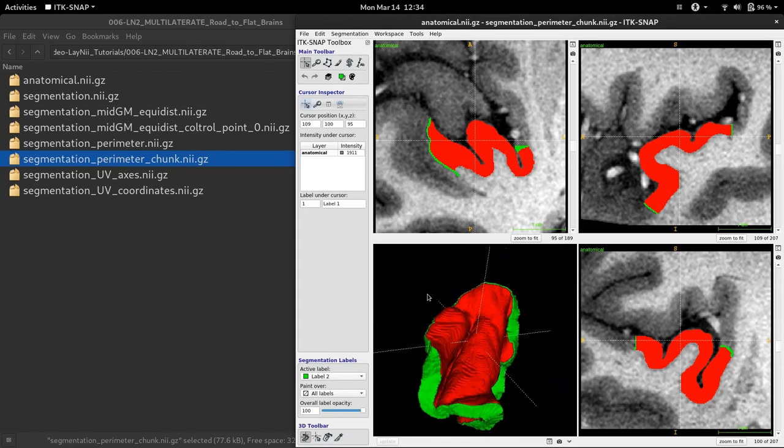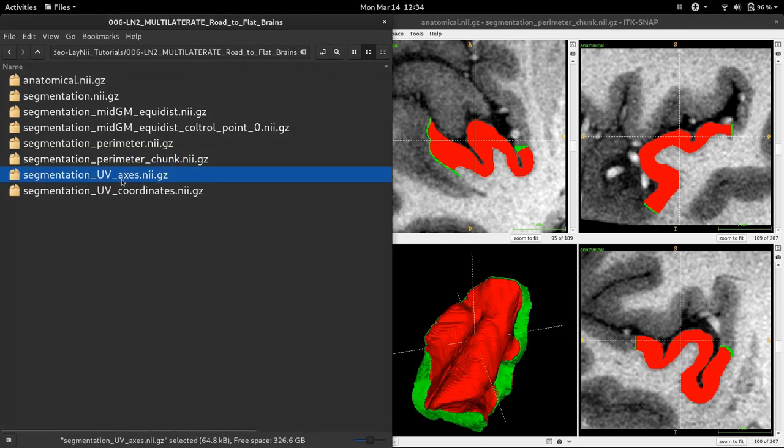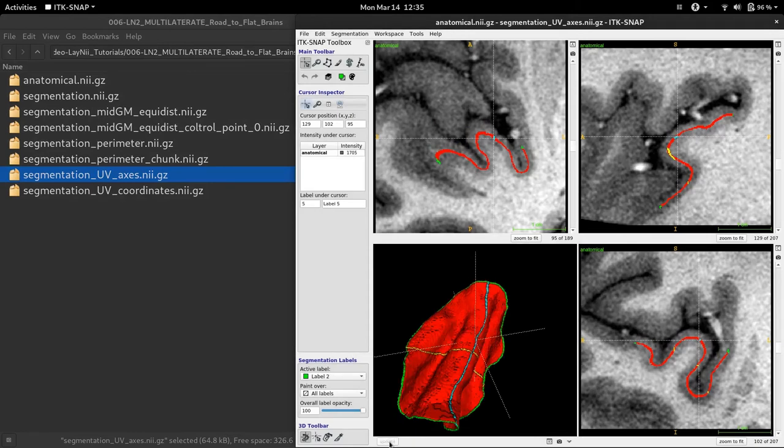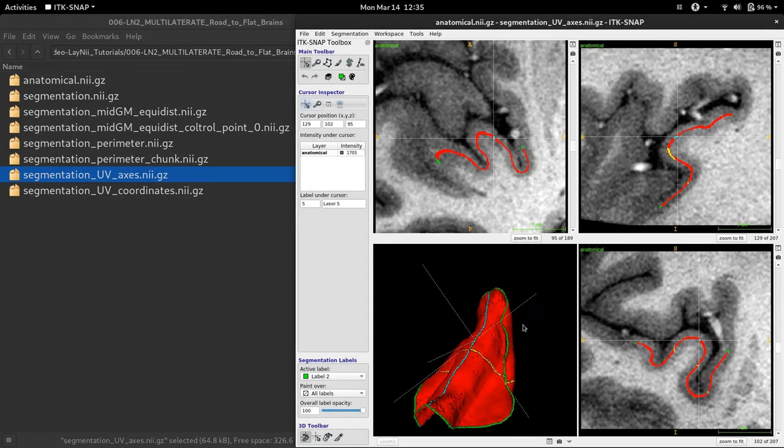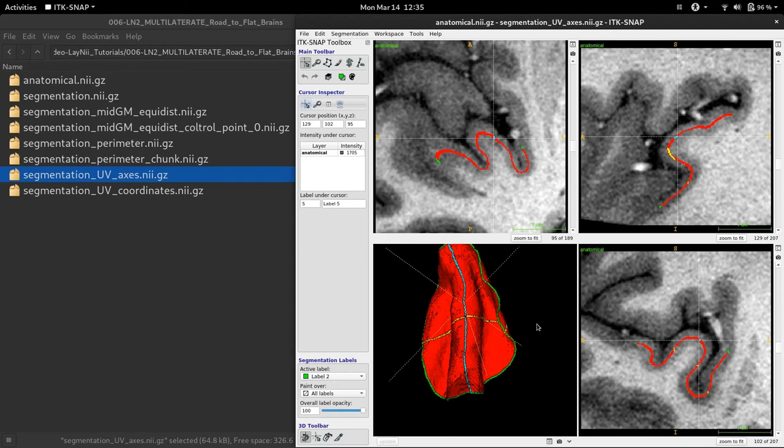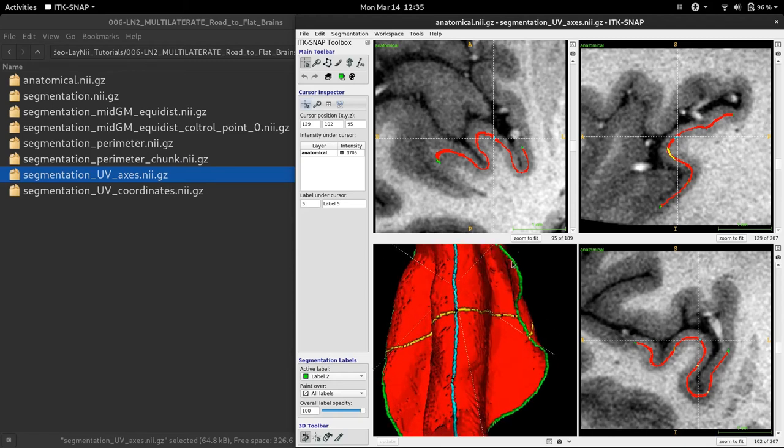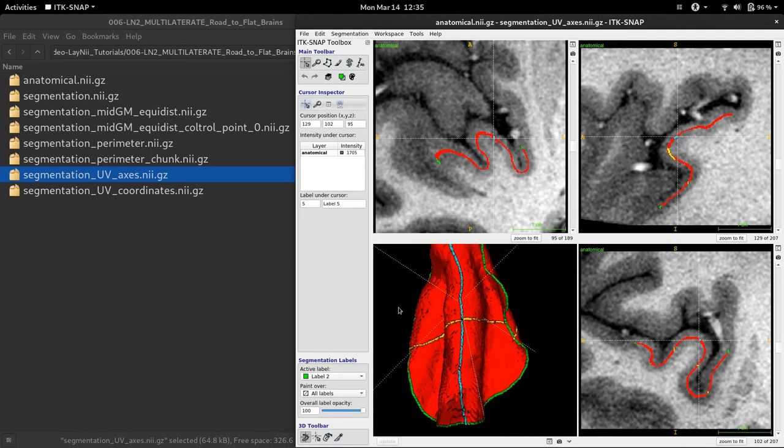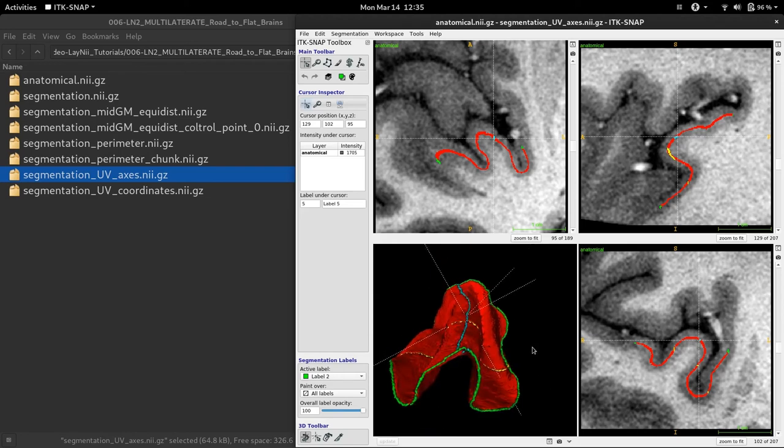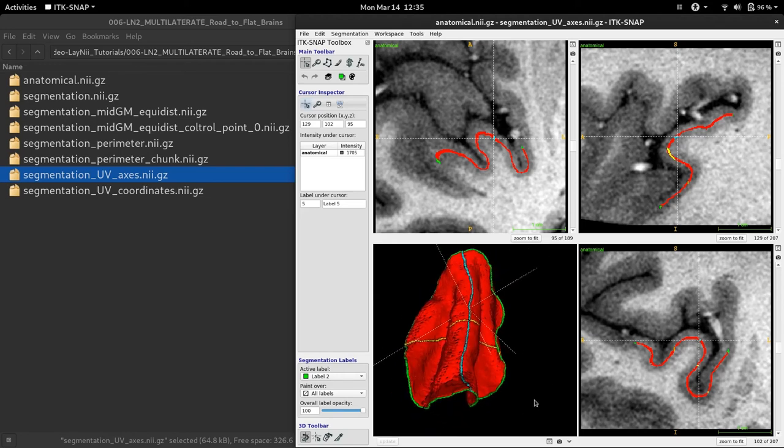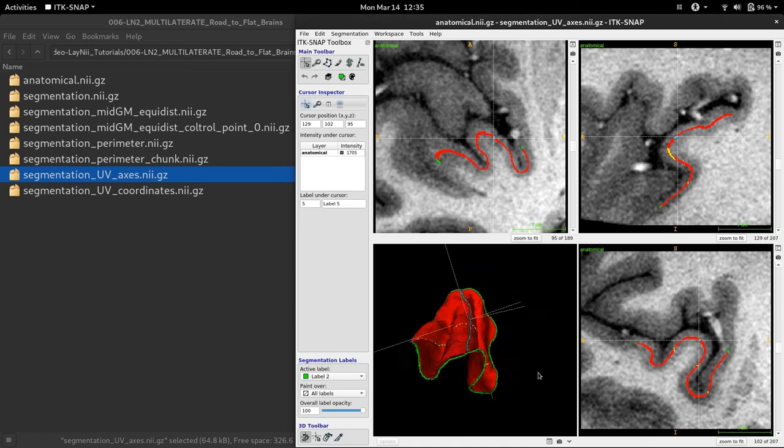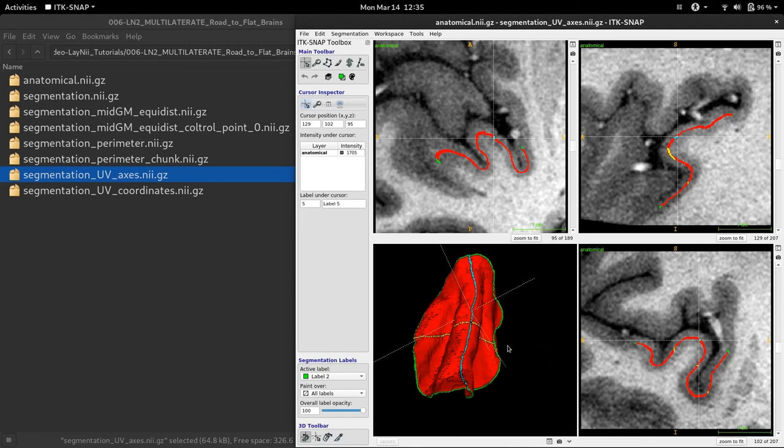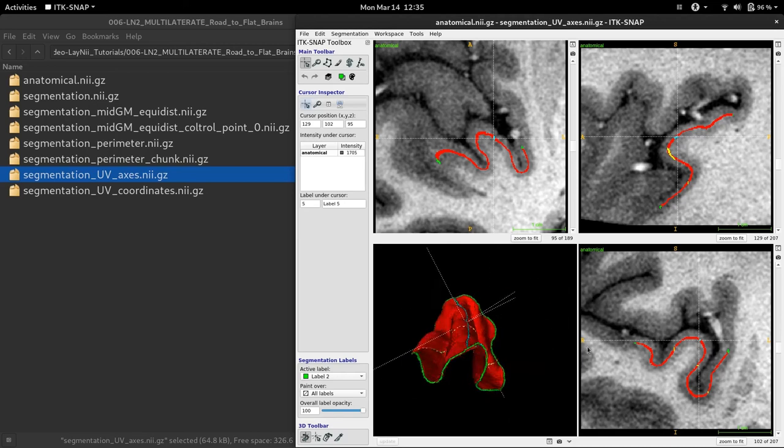Now, let's know our other output, the UV axis. This file, again, I use the update button in ITK snap to see what is included. And here, you can see that this file shows you the axis that it found. The epicenter of the flat coordinate system, denoted with blue. And the first axis in yellow. And the second orthogonal axis in cyan. So, this output is quite useful to check if the orthogonal coordinates worked correctly. It seems all fine. Looks pretty nice.